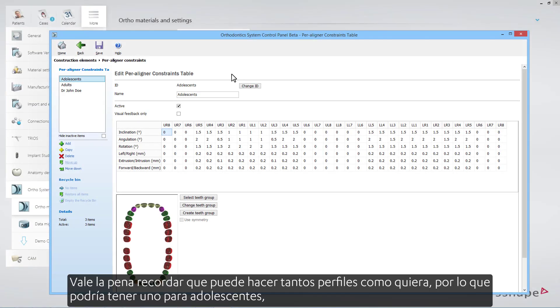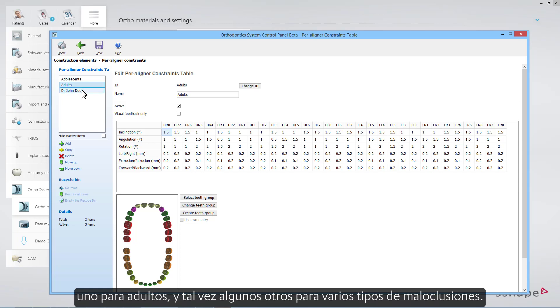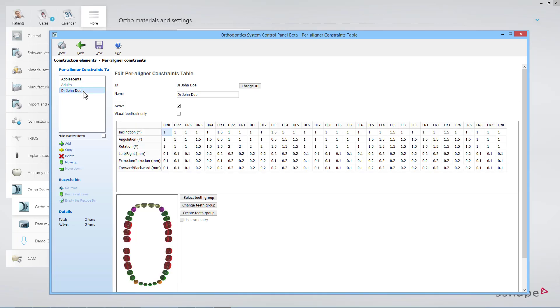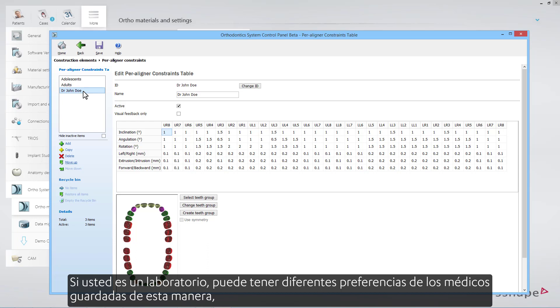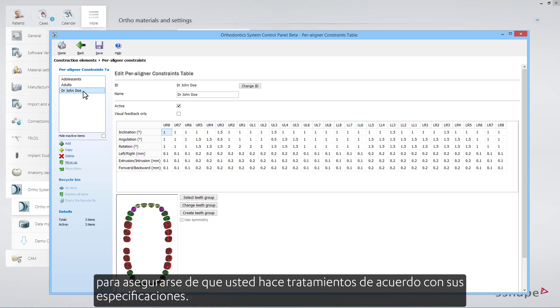It is worth remembering that you can make as many profiles as you want. You could have one for adolescents, one for adults, and perhaps some others for various kinds of malocclusions. If you are a lab, you can have different doctors' preferences saved this way to ensure that you make treatments according to their specifications.